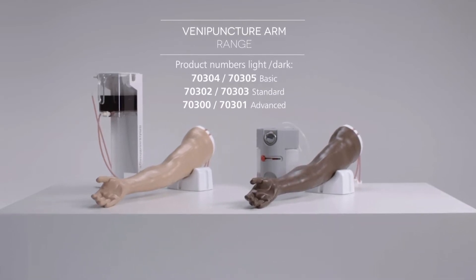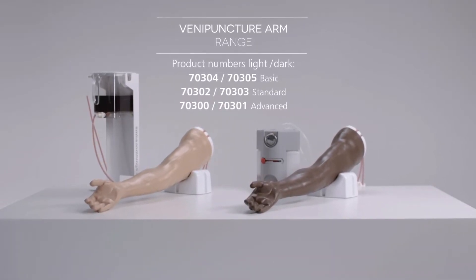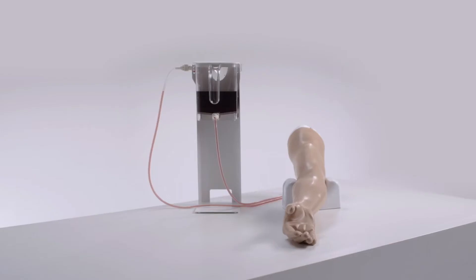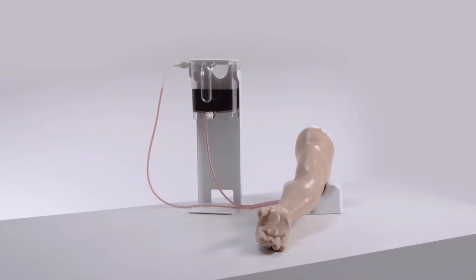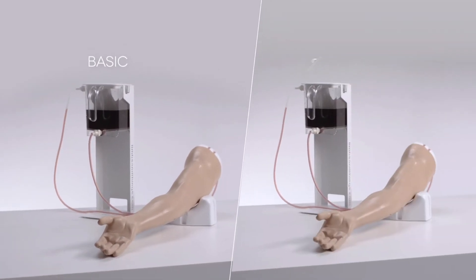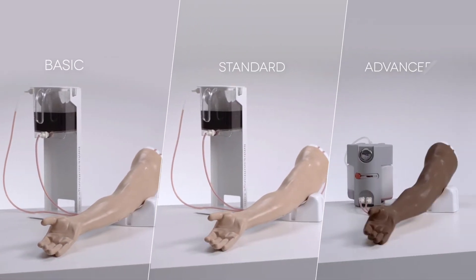This is the Limbs and Things Venipuncture Arm Range. Designed to support all levels of training, it includes basic, standard and advanced venipuncture arms.